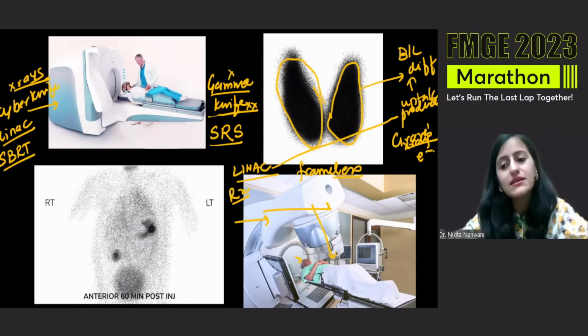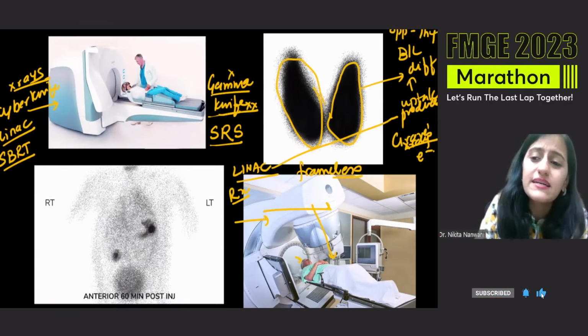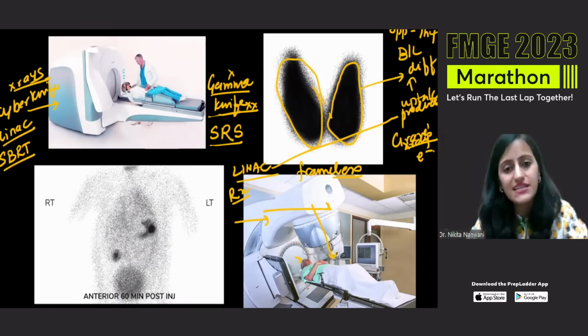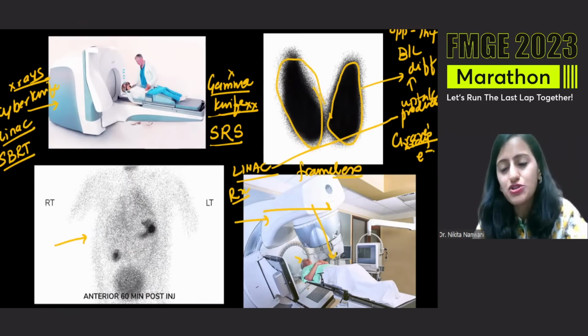It is diffuse thyroid, which is black. So that is Graves'. Opposite, bilateral, diffuse, decreased uptake, burnt out thyroid is thyroiditis. Thyroiditis is diffuse, decreased uptake. Graves' is diffuse, increased uptake. Thyrotoxicosis.